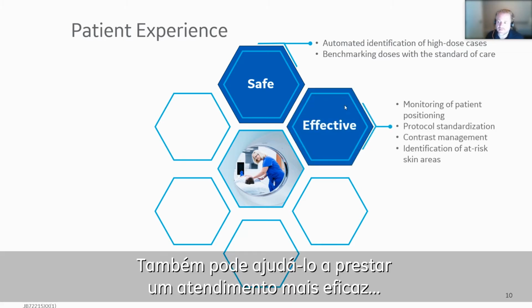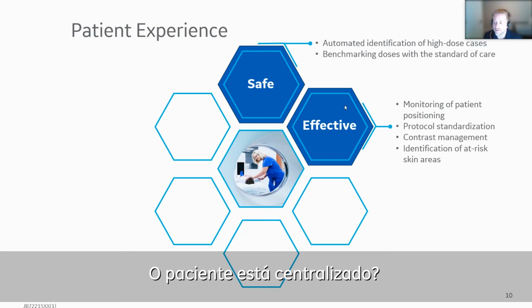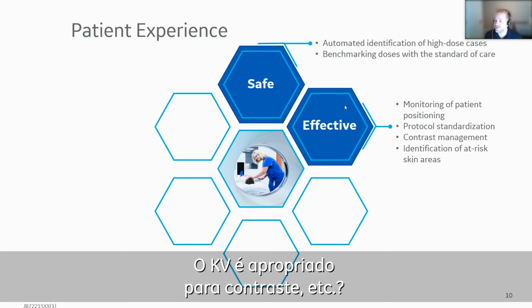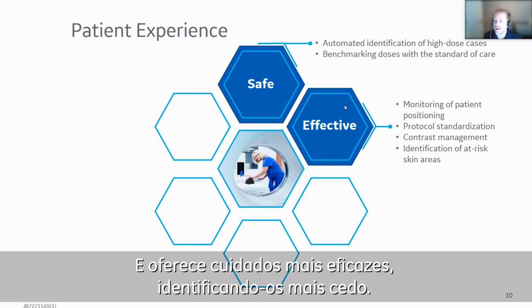It can help you provide more effective care as well, because these systems have the capability of monitoring, for example, patient positioning in CT. Is the patient centered? Are my protocols standardized? Am I using contrast in a consistent way? Is kV appropriate for contrast, and so on? Or it can help you identify patients who are at risk of skin effects due to high exposures in fluoroscopy, right? And give them more effective care by identifying them early on.